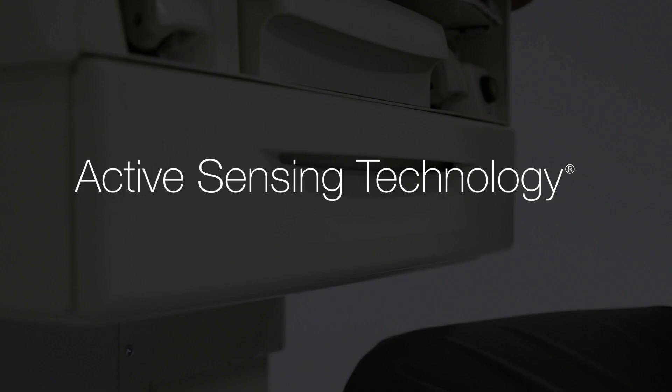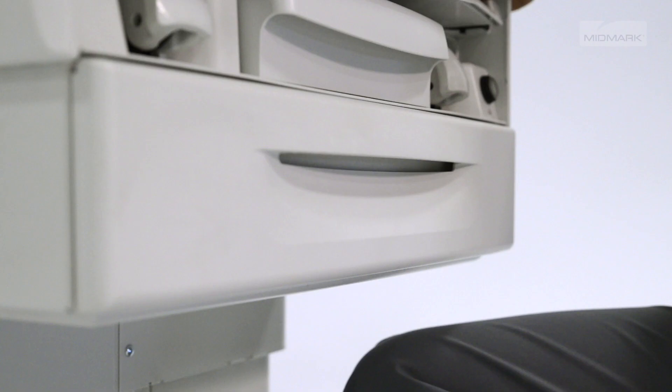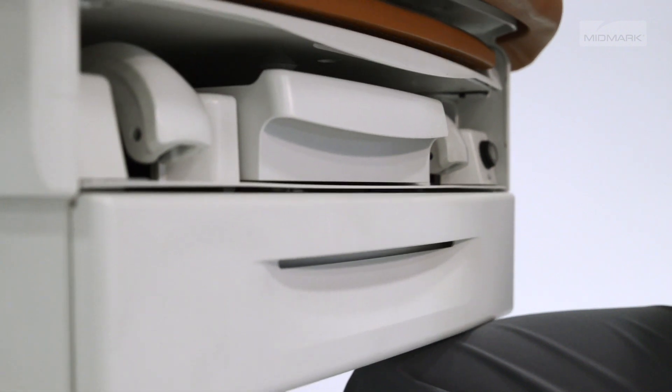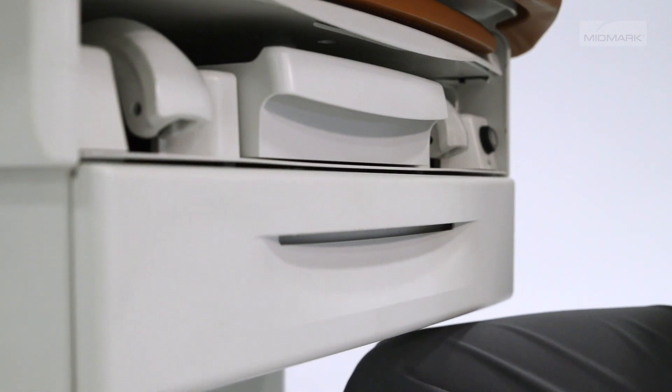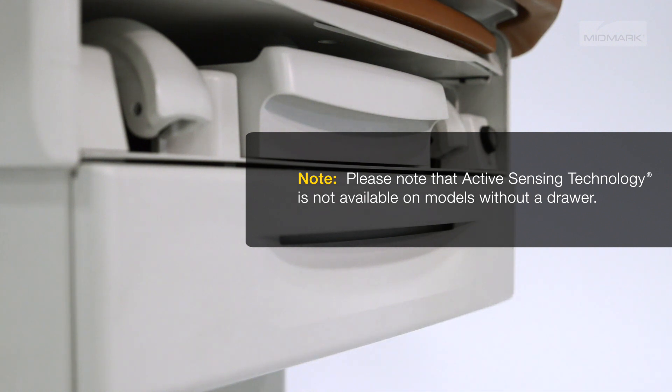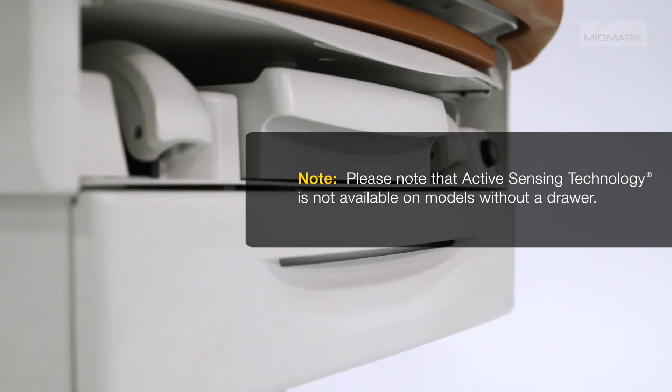Active sensing technology prevents the chair from moving down if the bottom of the drawer contacts another object. If the active sensing technology is activated, it will sound a series of beeps. Disable the base down function and move the chair in the base up direction. To resume base down operation, remove the object from under the bottom of the drawer and press the base up/down buttons on the controller.